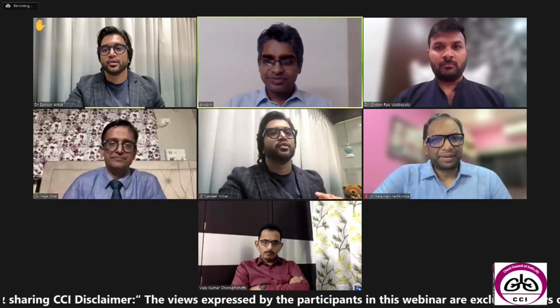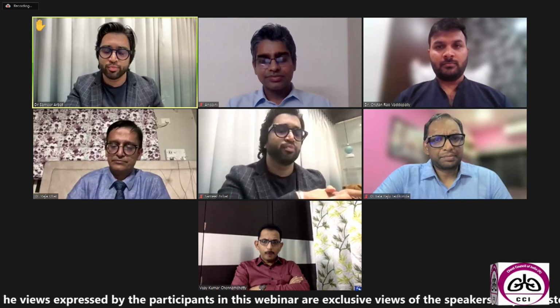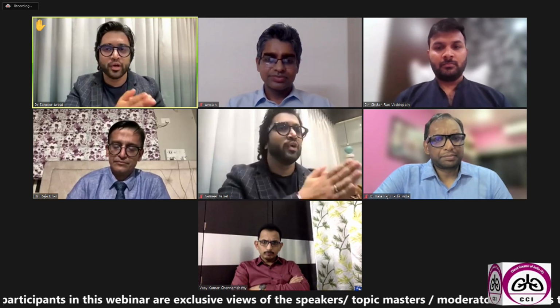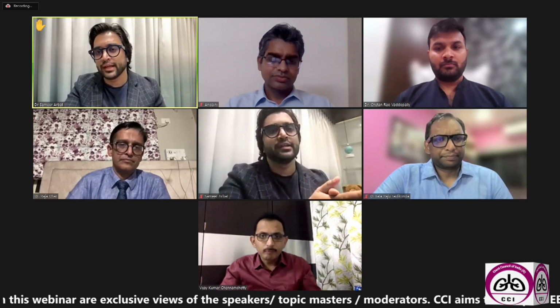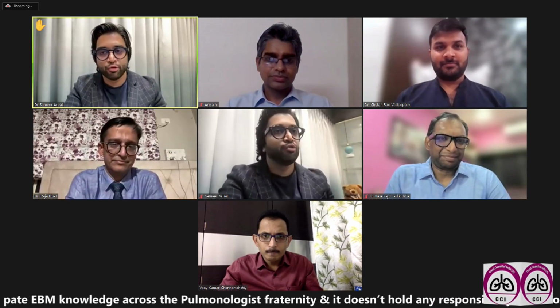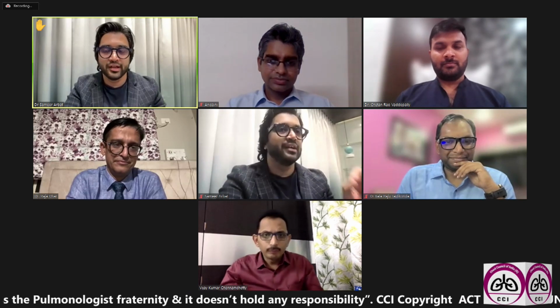Samir. Yeah. So basically now there has been a shift. What is available right now is the second generation of probes, which are single use disposable probes. Now we have the 1.1, 1.7 and 2.4. These are the three sizes. The reason for this is that the US FDA says that you cannot reuse any machine which is non-autoclavable. So these probes were non-autoclavable, and the company stopped producing reusable probes. Now what we have is a single-use probe. You are lucky if you bought a reusable probe before this came into action, because you can use it for the next 100 cases also. But right now we have only the 1.1, 1.7 and the 2.4 single use probe.